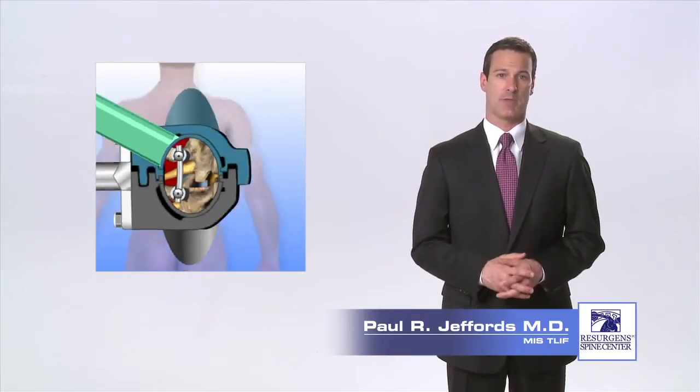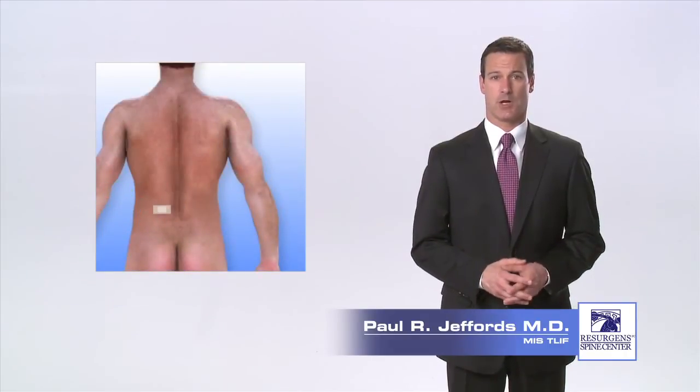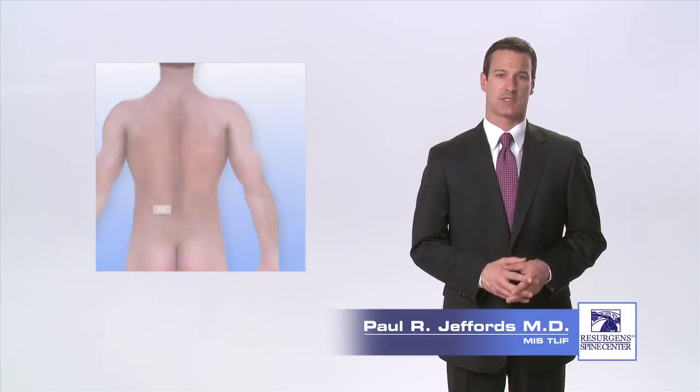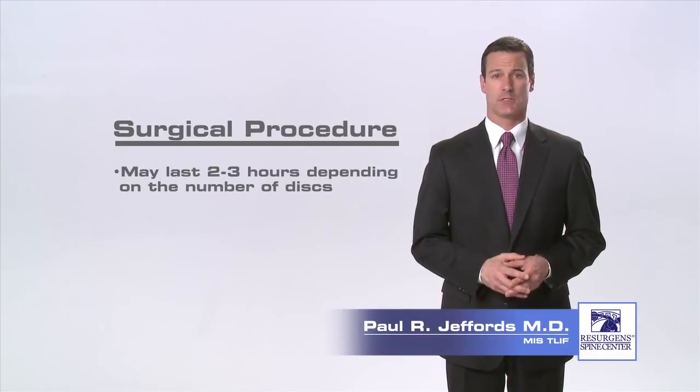A second incision may be made on the opposite side of the spine to place additional screws and a second rod. The incisions are closed with resorbable stitches that are placed beneath the skin. A typical MIS-TLIF procedure lasts approximately two to three hours, depending on the number of discs to be fused.